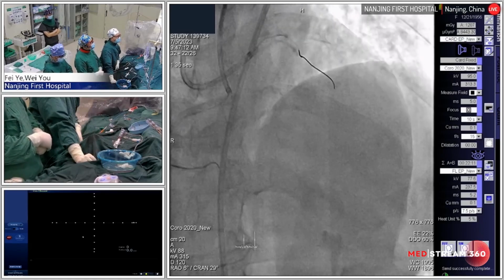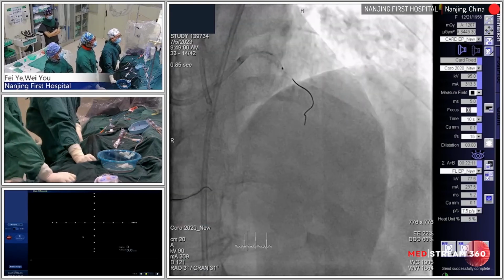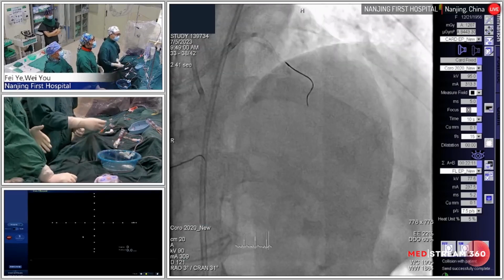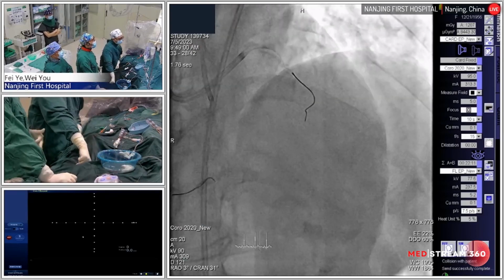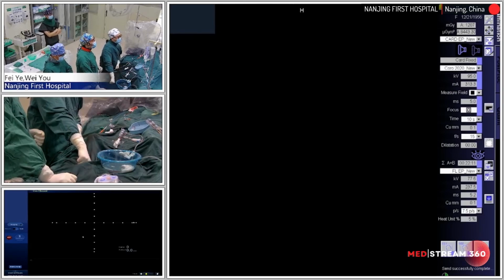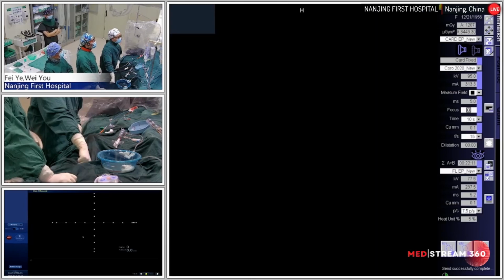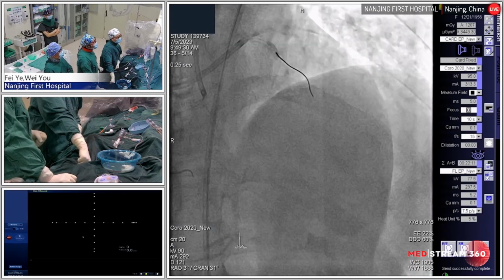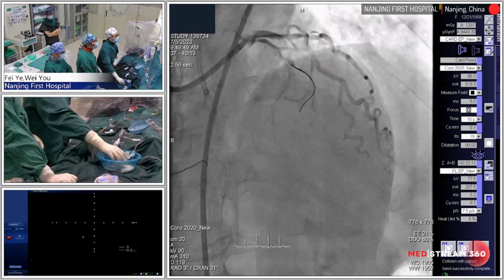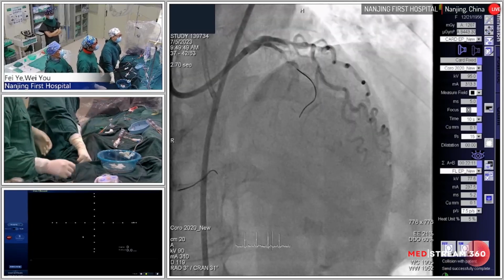Next, please. Unfortunately, you can see the Fine Cross microcatheter just wants to follow, but it does not succeed and cannot pass. The sharp lesion also has calcified plaque. So next, please. I use the 1.5 balloon to predilate. Next, please. You can see the balloon does not expand well, and you can also see the contrast staining. It seems that the lesion is very tough.